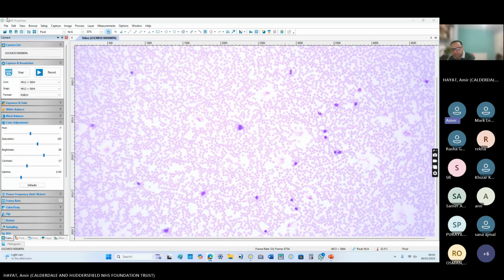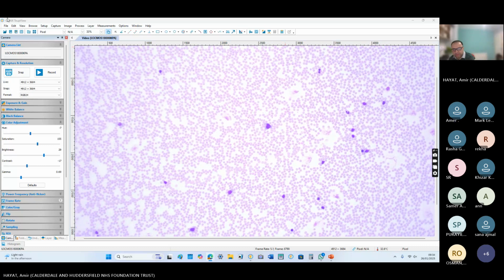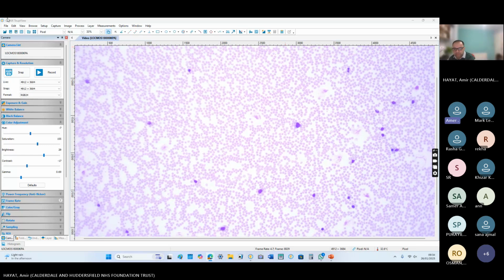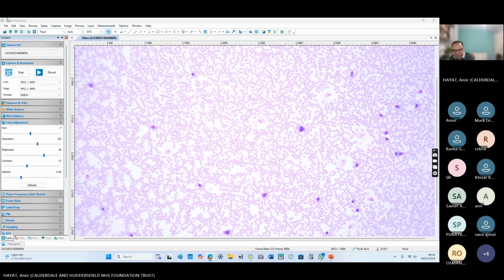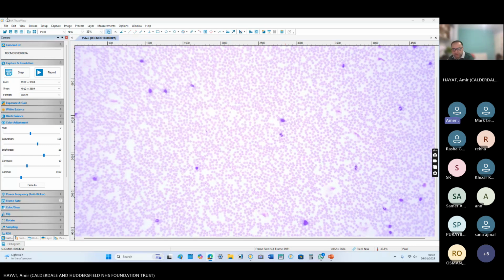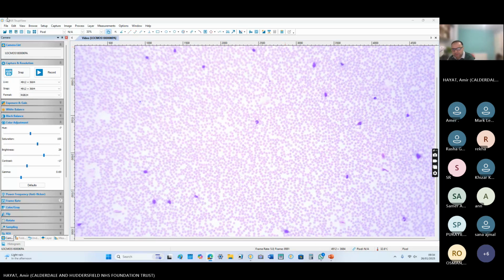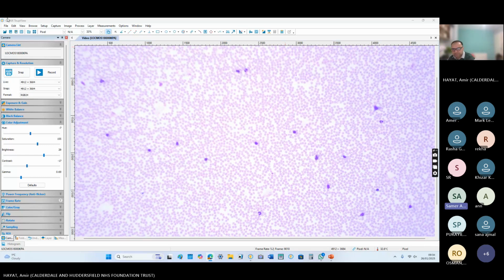So this is a 23-year-old female patient who has fever and lymphadenopathy. The full blood count shows that hemoglobin is 122, white cell count is 17, and the platelet count is 210. The blood film has gone to the lab scientist or lab hematologist first. Let's see if he thinks this is lymphoma or leukemia. This is power 10. Lymphocytosis and neutrophilia.